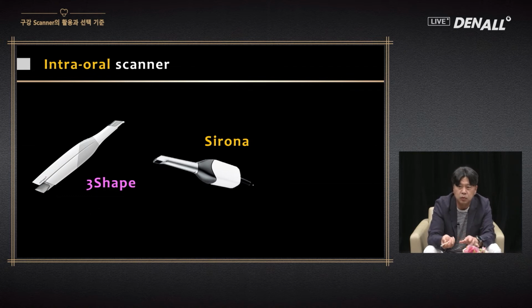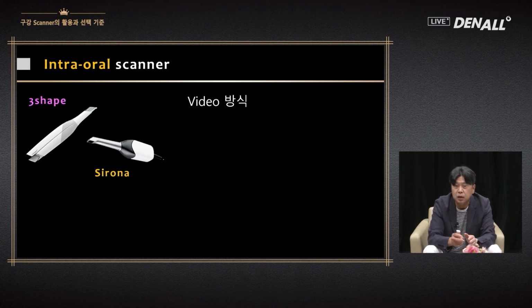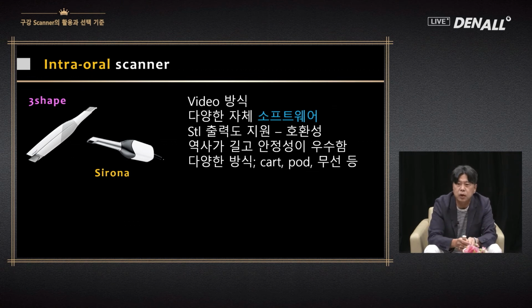Trio scanner from 3Shape, Omnicam or PrimeScan from Sirona, Medit, and other third-party players have scanners. I'm not trying to say a specific brand. They are the representative ones.